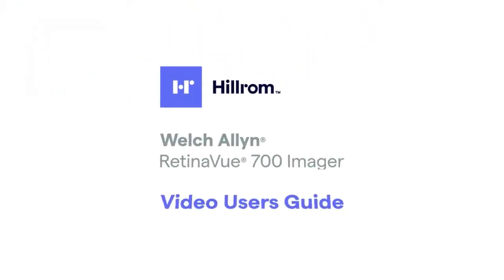Welcome to the Hillrom Welch Allyn RetinaVue 700 Video User's Guide.